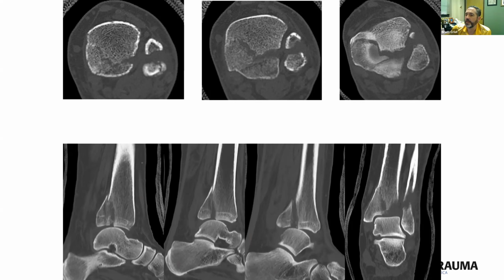I was going to ask Mitch, since you are savvy with the circular frame, what do you think about doing gradual distraction and then coming back? I probably would not do it here. Just from the lateral X-ray, for me, I think more of buttress mode, so posterior approach and buttressing the posterior malleolus. I agree with Tim's comments before.